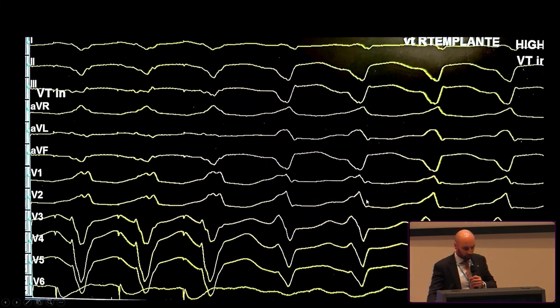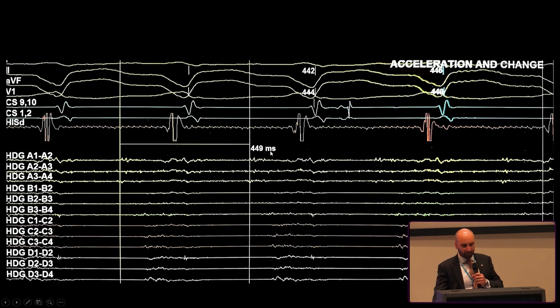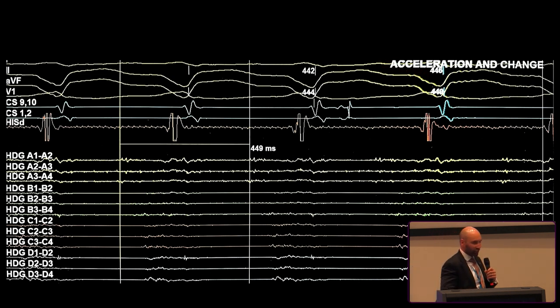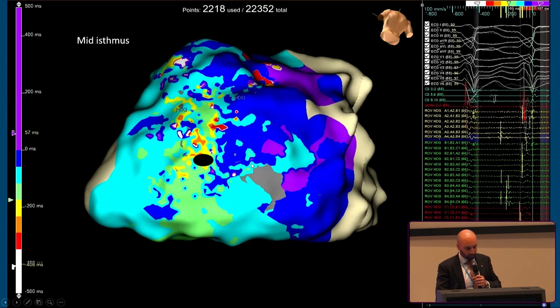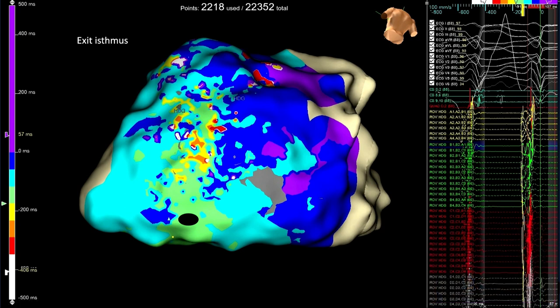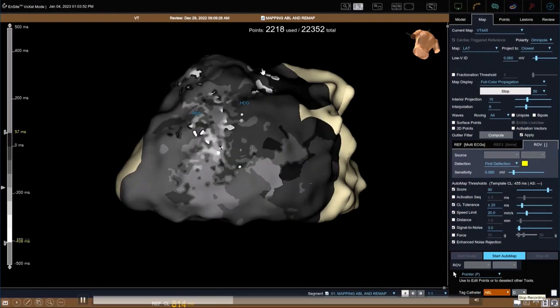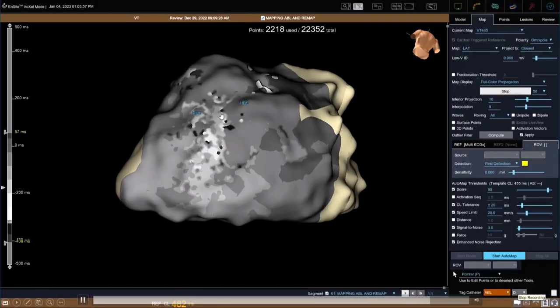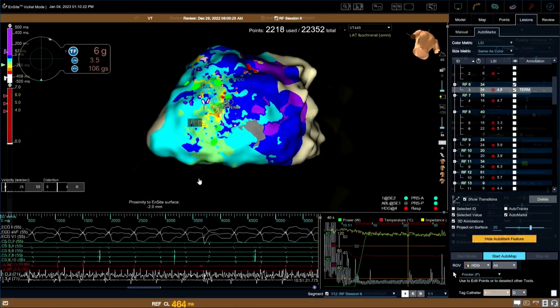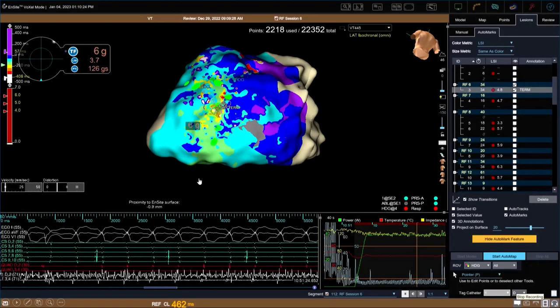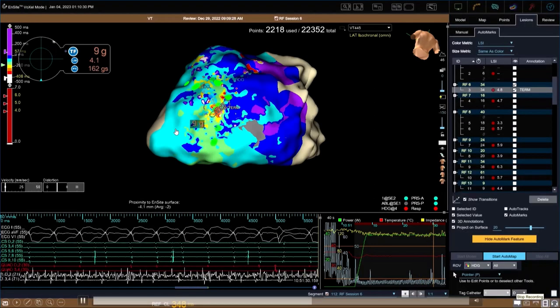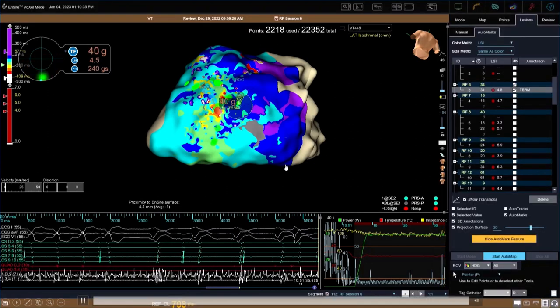VT is induced easily—a right bundle morphology VT with an apical exit from the inferior wall. Using what Roderick Tung calls stamp mapping (strategic activation mapping), we placed the HD grid in the area of interest, induced VT, and immediately saw mid-diastolic potentials at the mid isthmus. We also have exit isthmus signals and entrance signals. The VT propagation map shows that part of the entrance is concealed, but we have the larger components of the mid and exit sites. Using the Taktiflex ablation catheter at 40 watts targeting the mid isthmus, we see VT termination.